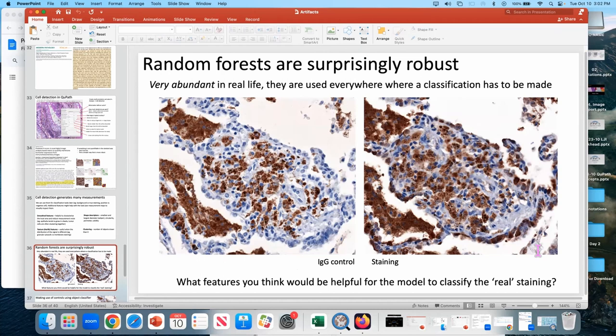So now looking at that image and knowing that this is an isotype control, there should be no staining. And this is staining for SARS-CoV-2 in the epithelial cells of the lungs. And that messy staining, that's not really true. What would you think would be the features in the object classifier that you could use? Is the color different? The darkness, is it different? No. Is the pattern different? Nah.